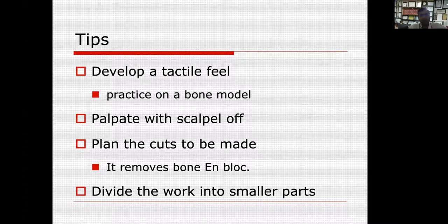So the tips are: you have to develop a tactile feel, so you can practice on a bone model beforehand. You can palpate with the scalpel off. When you're reaching the inner cortex, you can always feel, with the scalpel off, whether you have breached the inner cortex or not. Always plan your cuts before and divide the work into smaller parts. One of the advantages is that you can take a large piece of bone with this, but it is always better to divide your work into smaller parts. So again, there are fewer chances of injury.